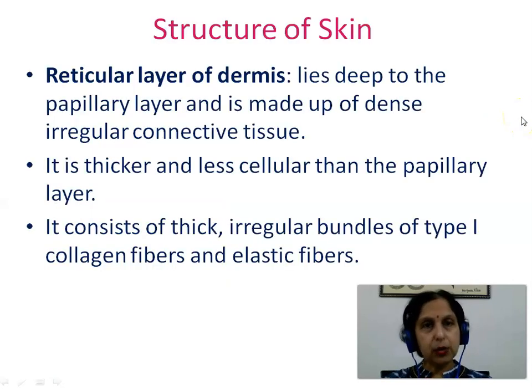Reticular layer of dermis lies deep to the papillary layer and is made up of dense irregular connective tissue. It is thicker and less cellular than the papillary layer. It consists of thick irregular bundles of type 1 collagen fibers and elastic fibers.